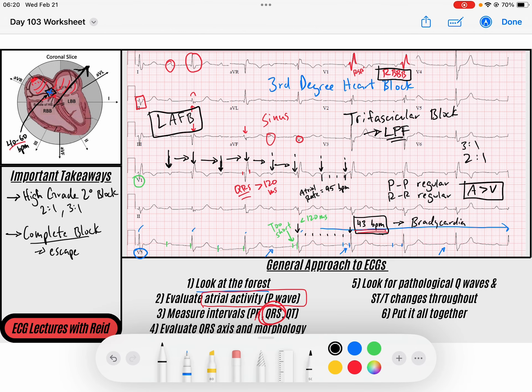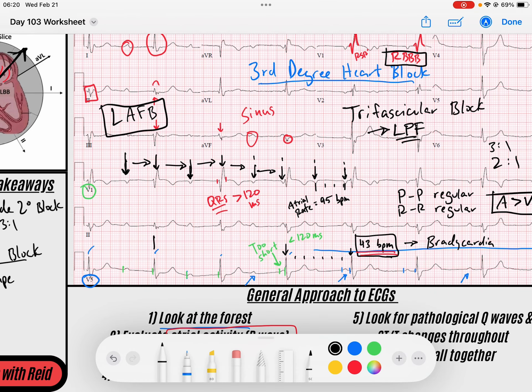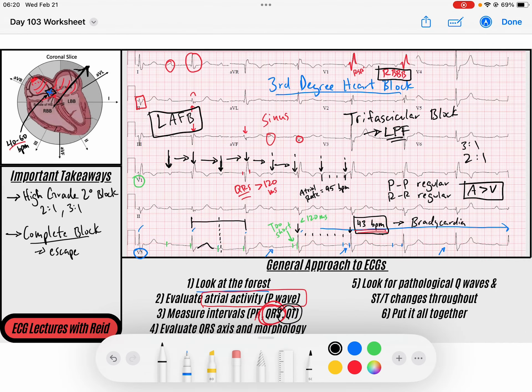For new learners watching this video, focus on the fact that this was a complete heart block with an escape rhythm. Looking at our QT interval - I measure from R to R - as long as my T wave ends by the midpoint, which it does, I'm happy with my QT interval. We look for pathological Q waves and ST and T wave changes throughout. I don't see any, so no active ischemia or previous infarction.